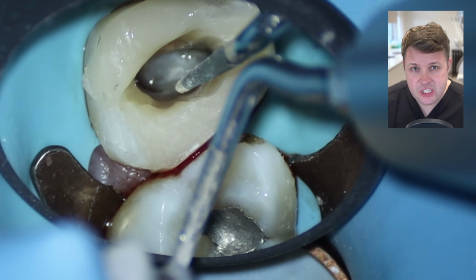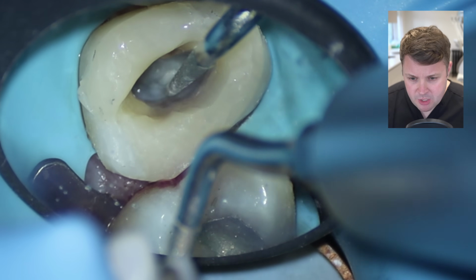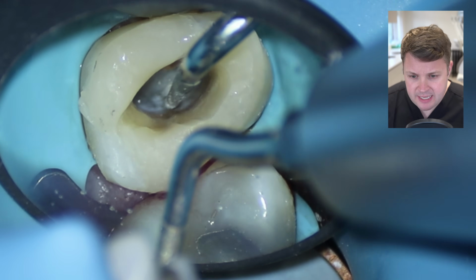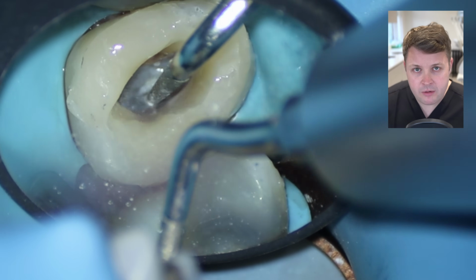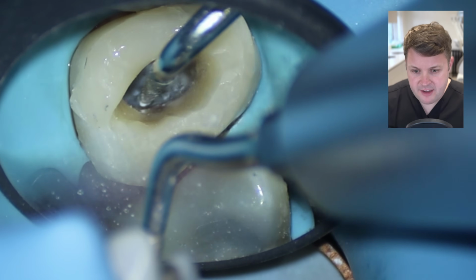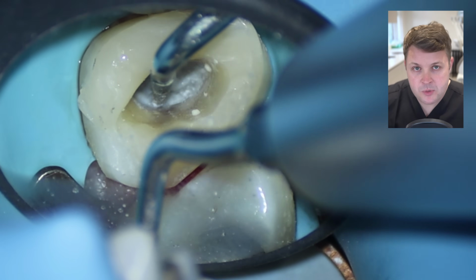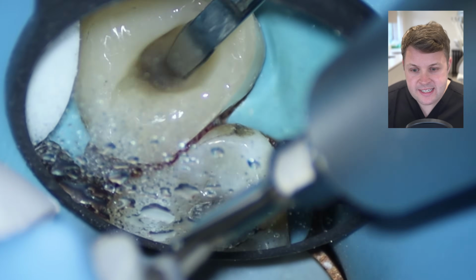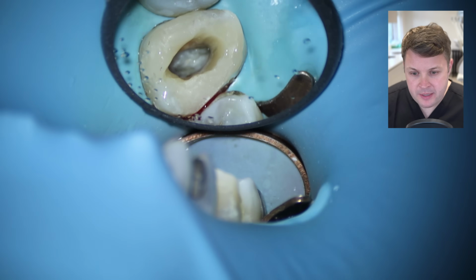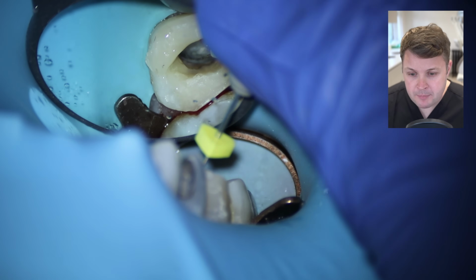Maybe this is a C-shaped tooth. But I have a little feel around here, and when I look at these canal orifices, there isn't a slither of canal or an isthmus between them. So I don't think this is a C-shaped tooth. But we can see that there is a DB. Granted, it is quite palatal to the MB, but it is the DB.